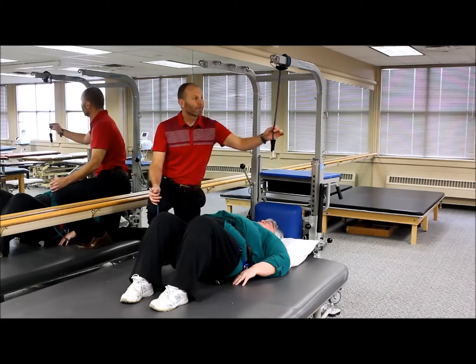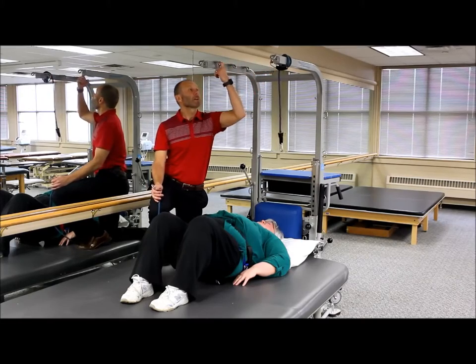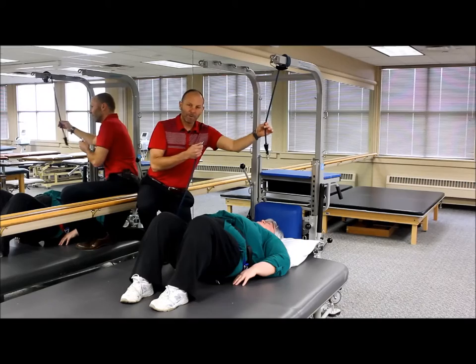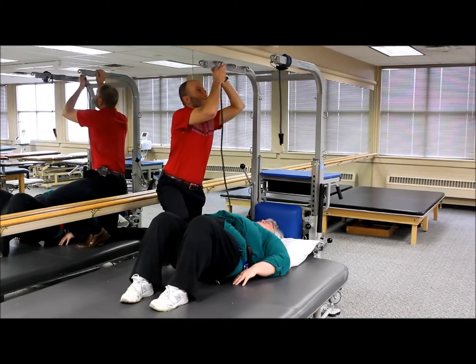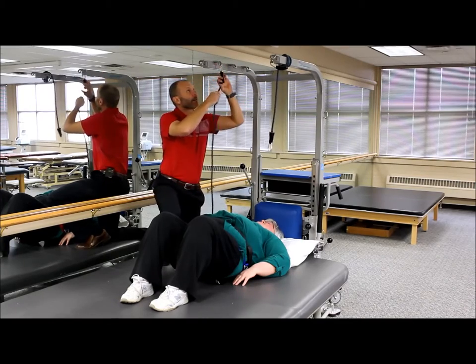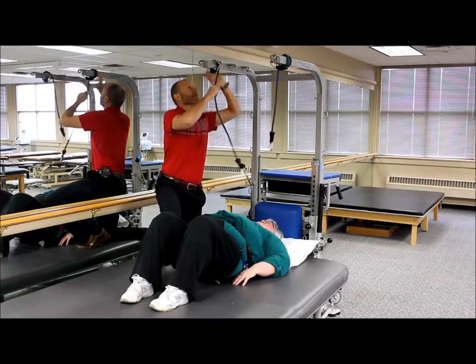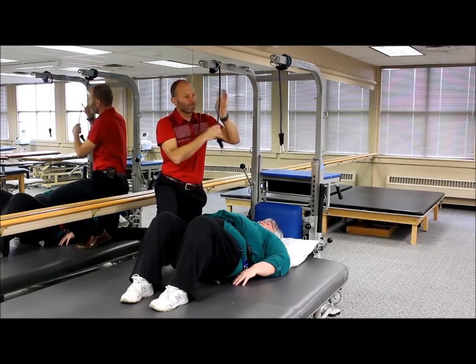What we've done is taken some of the bungees and attached them to our overhead support locations, simply wrapping them around as many times as we feel we need to get the level of assistance we want. I'm going to clip this on to our B-located attachment point and take it over three times — one, two, three — and take it behind so it can't slide off.